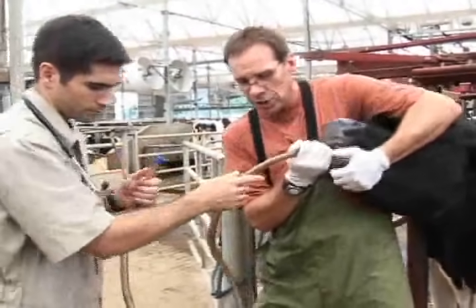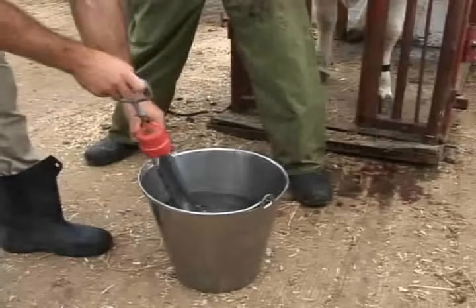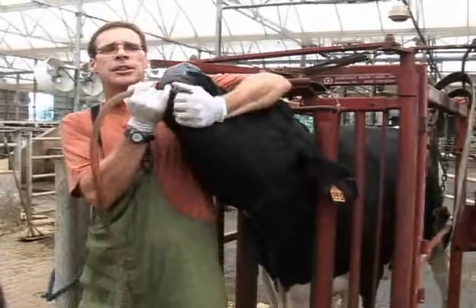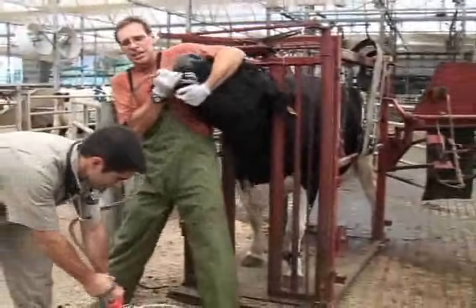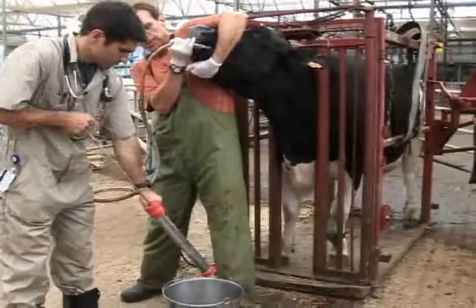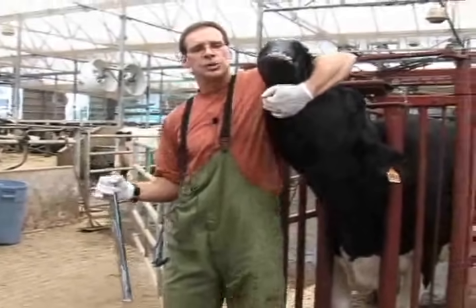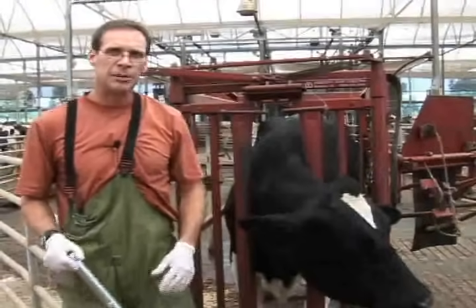We now know we're in the rumen, so we'll attach it to the pump. Holding on to the tube at the end, the assistant keeps it in place while we slowly pump, administering this large volume of fluids orally to this cow. You can see this cow is chewing aggressively on the Frick speculum but our tube is well protected. Once we're done, we pump a bit of air to clear the tube, take the tube off the pump, pinch the tube very aggressively, and walk straight back taking the tube all the way out. Then we remove the Frick speculum. She'll have her typical flehmen response, which usually means you've had a very successful procedure.